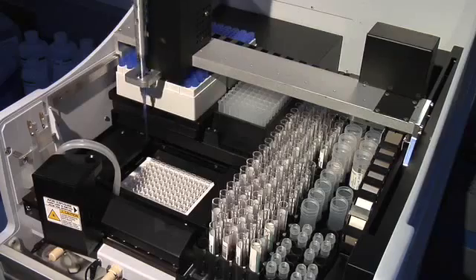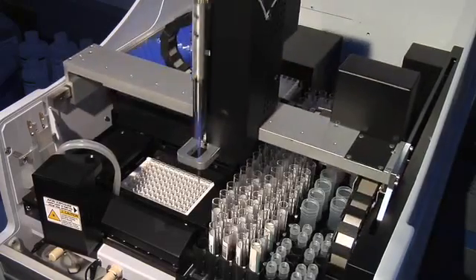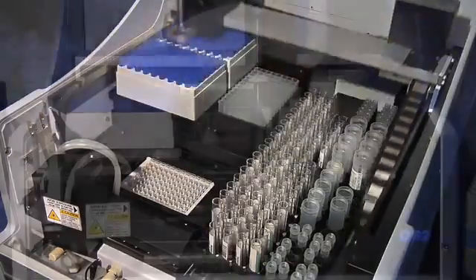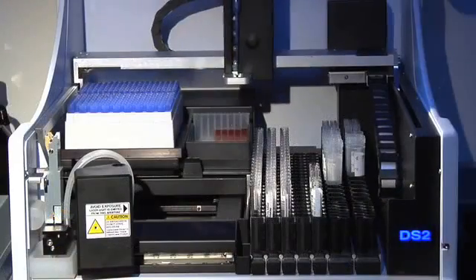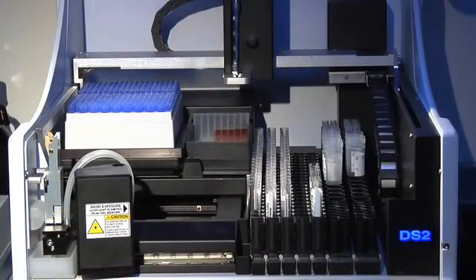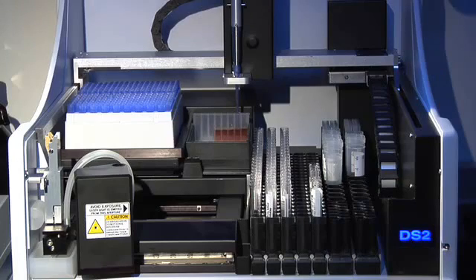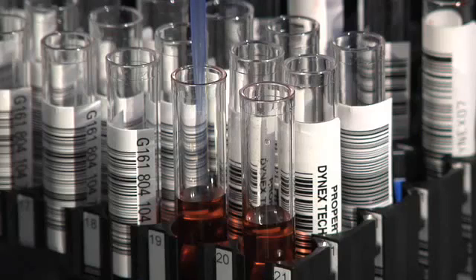The DS2 performs all functions automatically that were previously done manually, including sample dilution. The DS2 even does serial dilutions, important for many research applications.